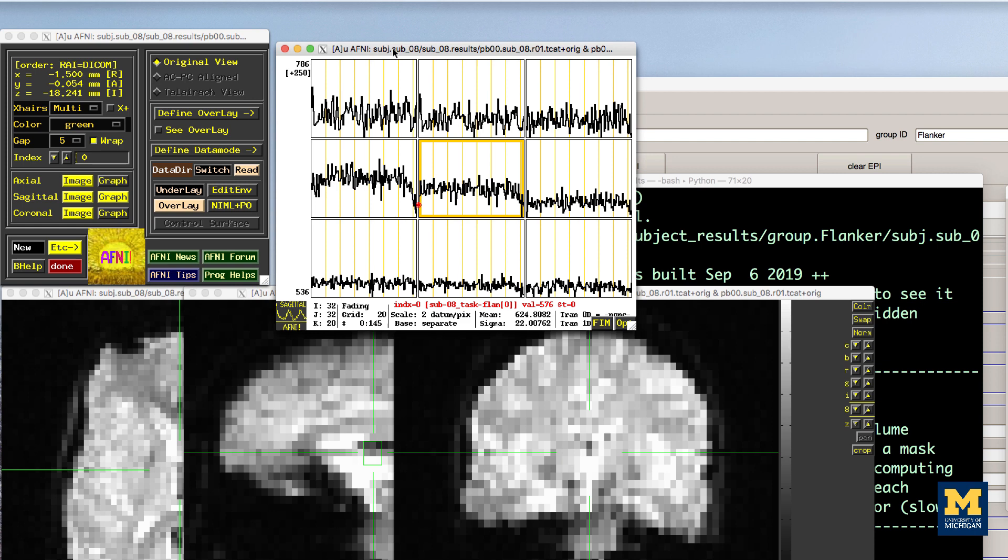Otherwise, we would see a large spike in the signal intensity at the beginning of the run.